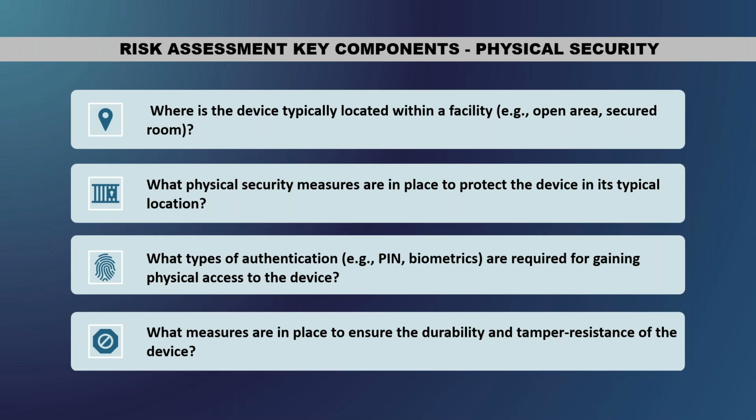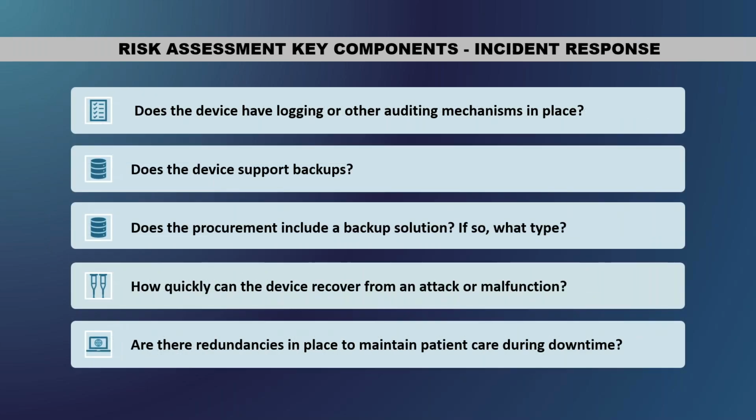Like if it's a laptop, how are they logging into it? A lot of systems that have mobile pieces of equipment, you'll notice it's for ease of access, which is great. But then maybe there's just a 1, 2, 3, 4 password, or it's completely open, just to give the clinicians ease of use. You still have to push the clinicians and say, okay, I understand it's ease of use, but if this laptop goes away, all the data goes with it. Next slide.